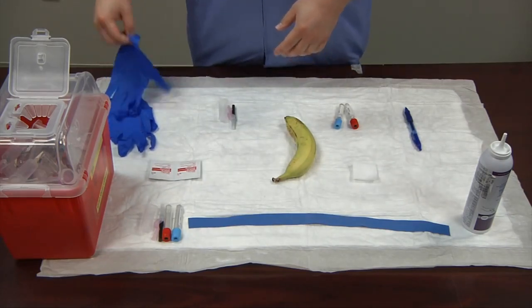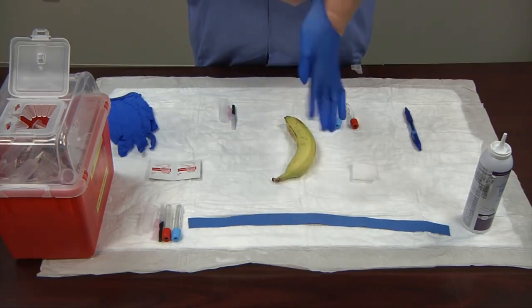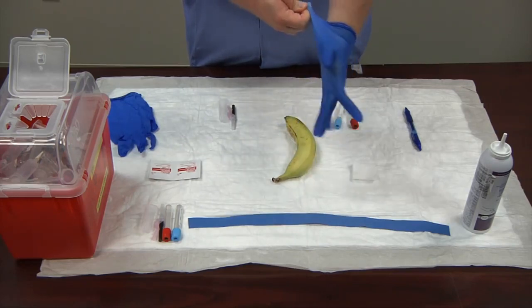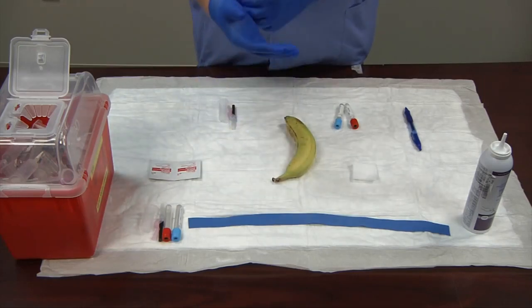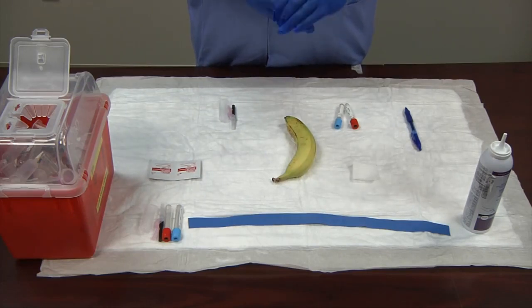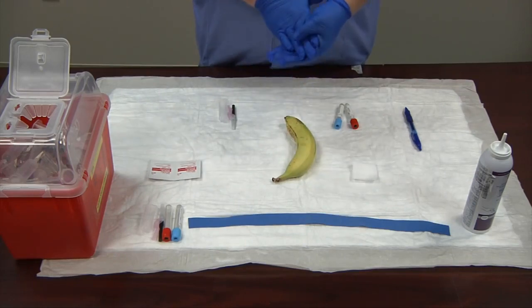Now I'm going to don my gloves. Make sure you have a good, tight, snug fit. My fingers are good and snug with not too much excess on the fingertips. In phlebotomy, you need a good tight feel against your fingers so you can palpate the vein easily.